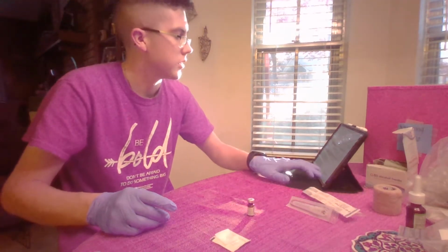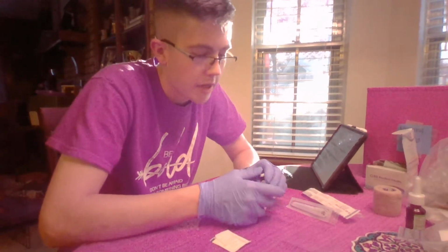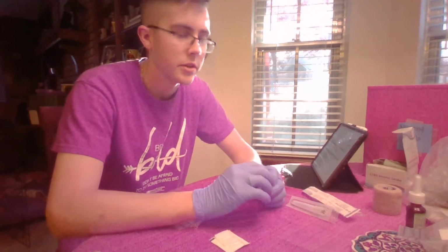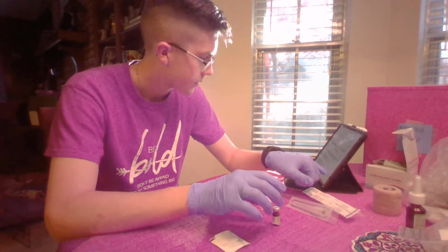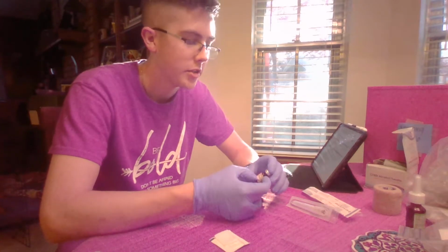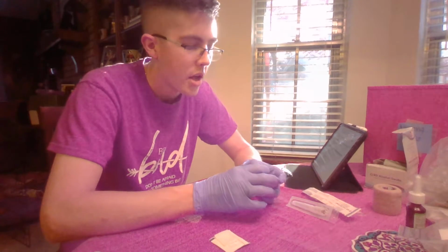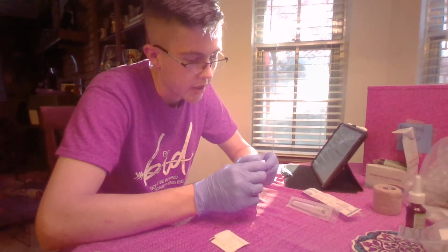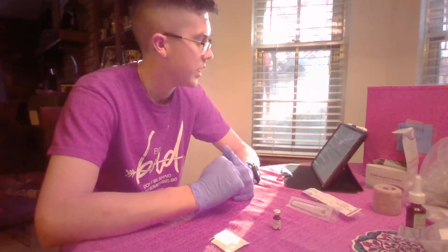All right, so starting back over, I will make sure that my patient is being ventilated adequately. I will make sure that I have gathered up all my materials and the appropriate things needed. Next, what I will do is I'll find my medication, make sure it is the correct medication, make sure that it's the right dosage, I'm giving it at the right time, I'm able to give it intranasally, as well as I will check for clarity and the expiration date, and then I will use 2 patient identifiers to check with my patient.